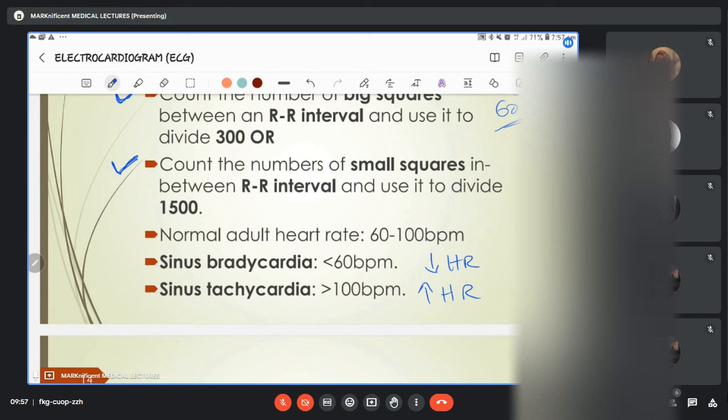So by the time you are trying to rule out so many conditions, there is no way any condition that falls under tachycardia applies if the heart rate of the patient is around 42 beats per minute. You shouldn't be thinking about any condition that has to do with tachycardia, that is increased heart rate. You should be thinking about bradycardia.